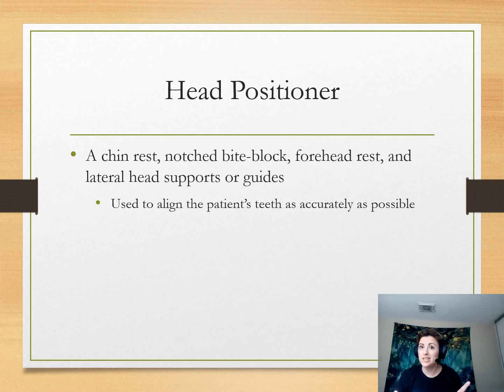Sometimes when you get your patient in there, you say bite on that little stick, right? And they bite way too far. So make sure you say, okay, bite. Now slide your teeth back until they fall into this little notch. And then they'll be in there, right? Also, you want to make sure that they're not biting on a tilt. You want them to be straight up and down, right?